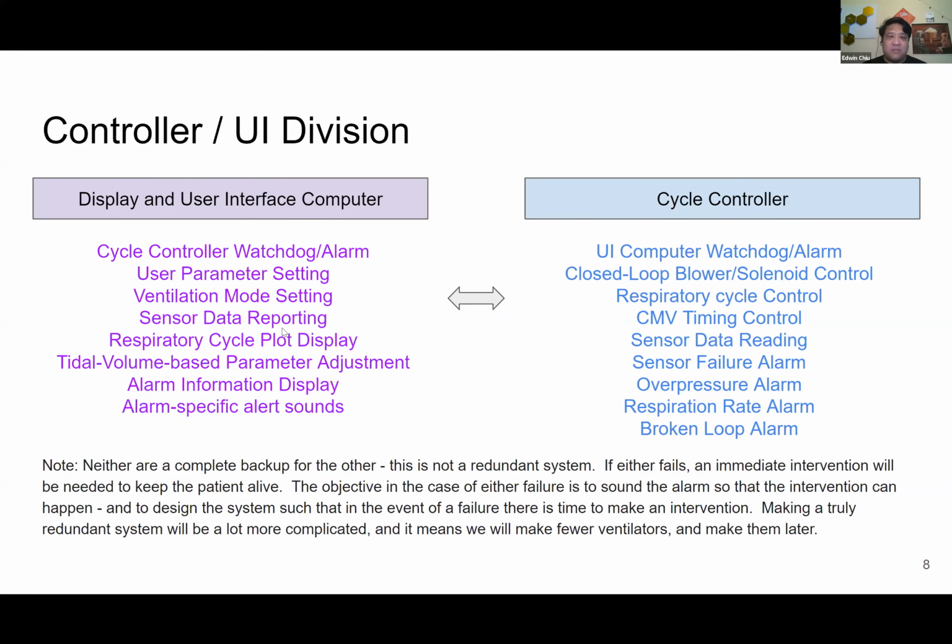Yeah, so what you're describing is essentially a watchdog timer, right? I'm saying have that pin default into a failed state in hardware on boot up without even being set by software. Certainly, and then it needs to be reset every so often, and if you don't receive a reset within a certain time frame, it goes back to failure. Yes, that's correct. Yeah, if you want to put a comment on that in the Slack channel, we can continue that in the Slack.